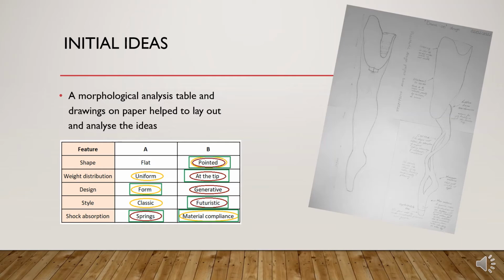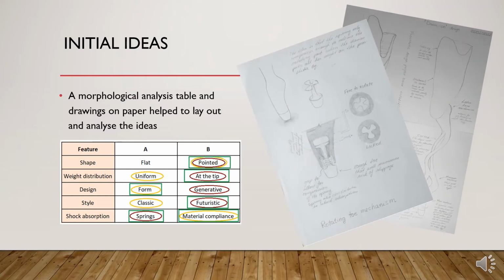A morphological analysis table was helpful in identifying the most suitable conceptual design to take forwards. To the right, you can see some of these concepts put to pen and paper, with the top one showing the bearing mechanism for spin.